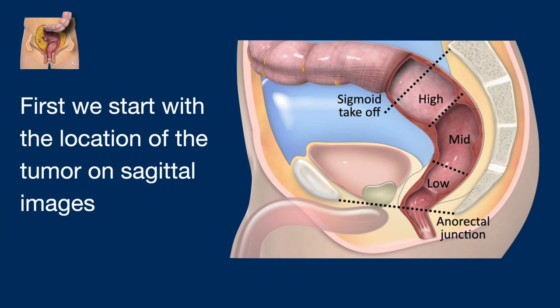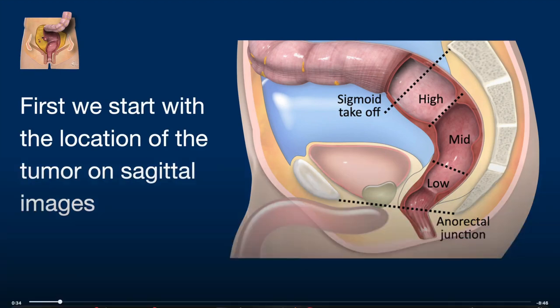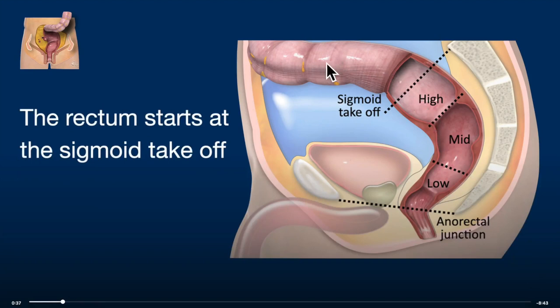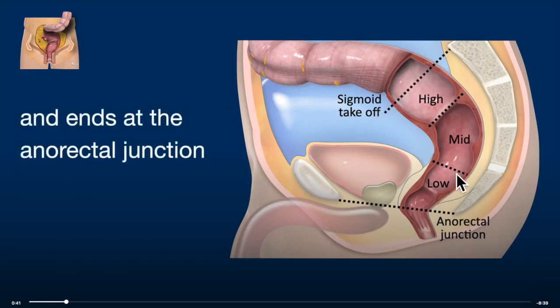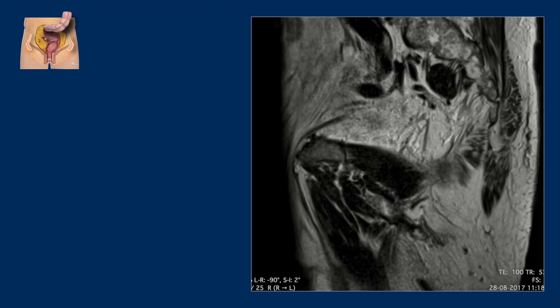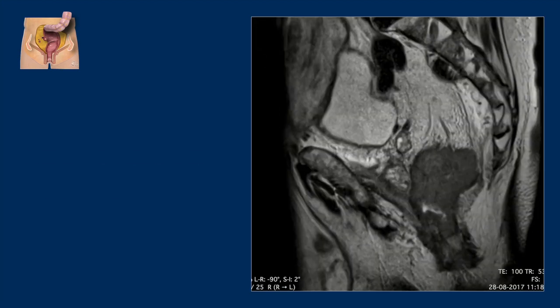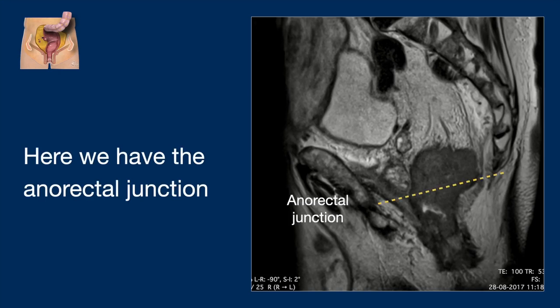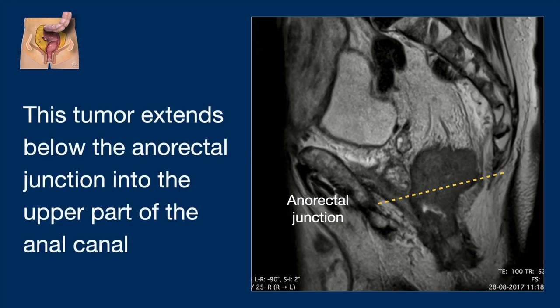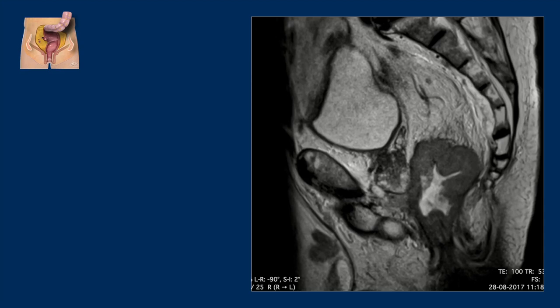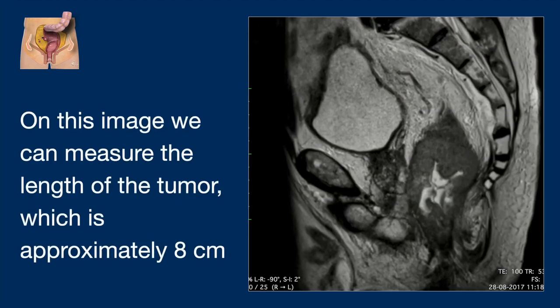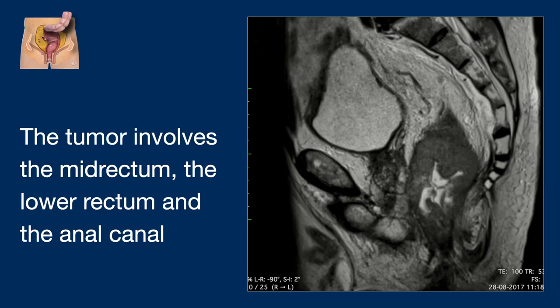We start with the location of the tumor on sagittal images. The rectum starts at the sigmoid take-off and it ends at the anorectal junction. This tumor extends below the anorectal junction into the upper part of the anal canal. We can measure the length of the tumor, which is approximately 8 cm. The tumor involves the mid-rectum, the lower rectum, and the anal canal.